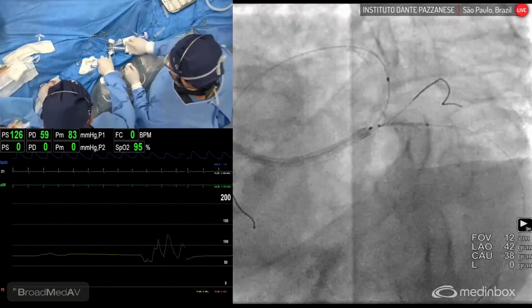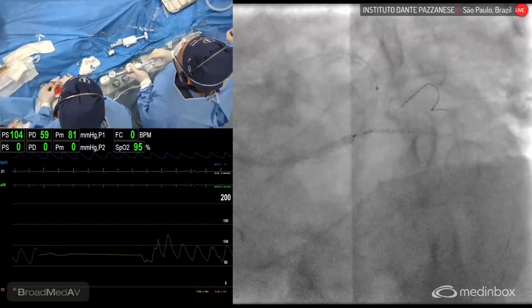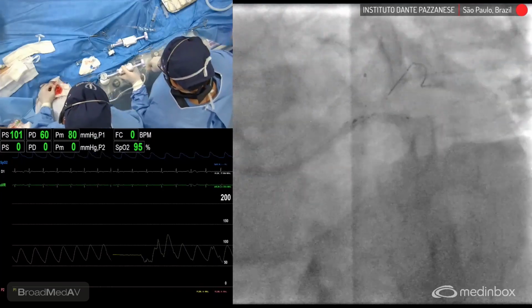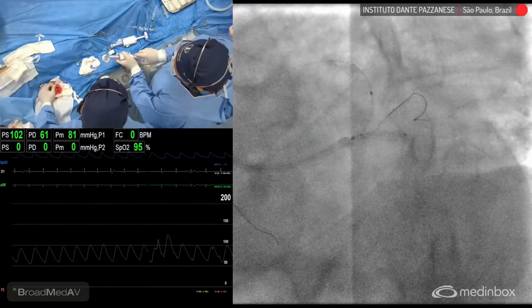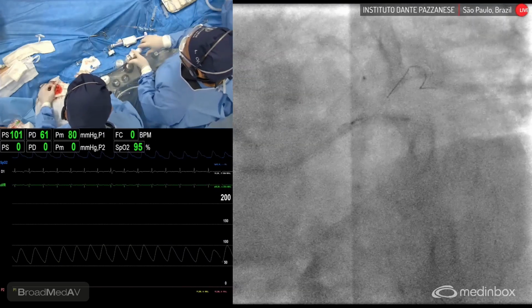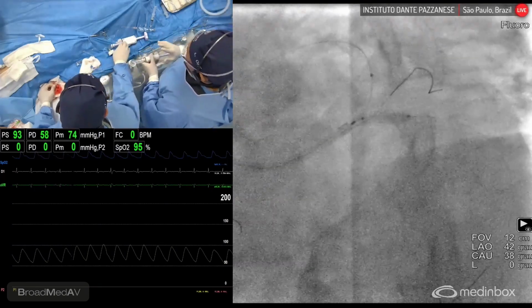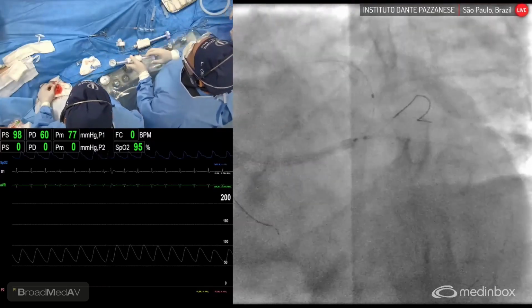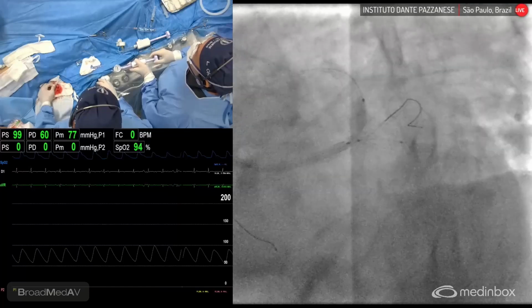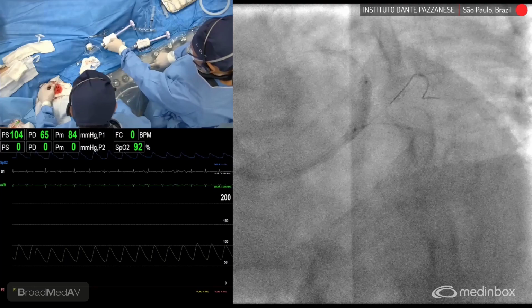So Luis is going to deliver the stent here, slowly. All of these implants should be very fast, shouldn't take too long. Up to 8. Okay, deflate. You can show the operators here. Okay, it's good. So the stent in the circumflex has been implanted, covering the ostium. So Rodolfo, now you can do a post-dilatation with the same balloon, just making sure that there is no protrusion.